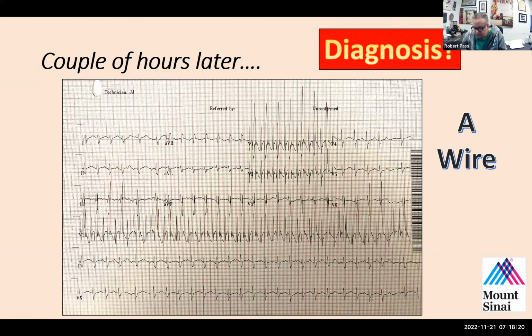I think what you're trying to say is if you're undersensing, there can be an APC that's not sensed, and then if it paces at a critically timed interval from the last atrial event, it can induce flutter in the setting of a heart that's got a tendency towards flutter. So yeah, this is usually related to undersensing.